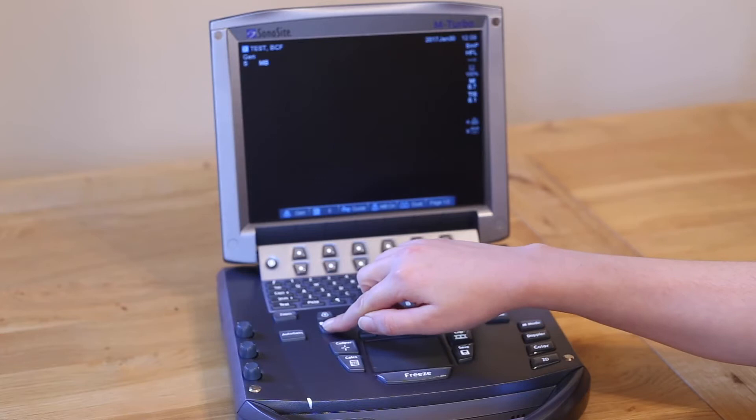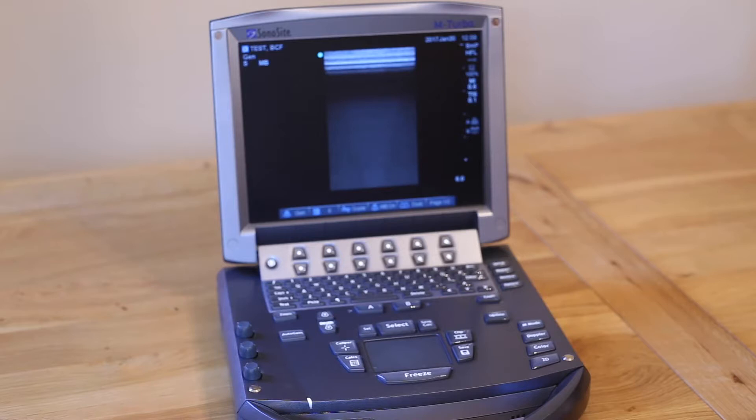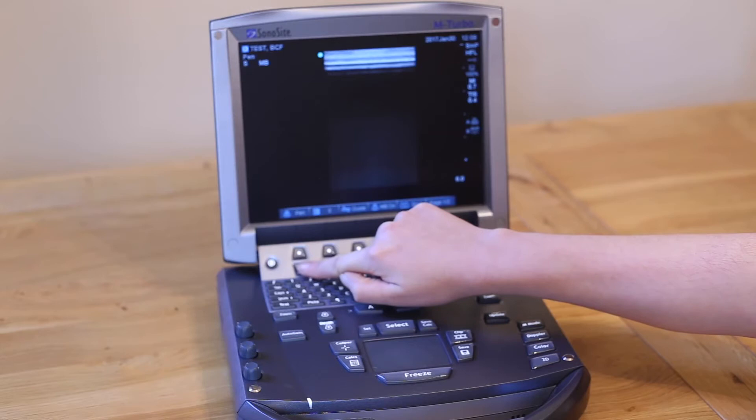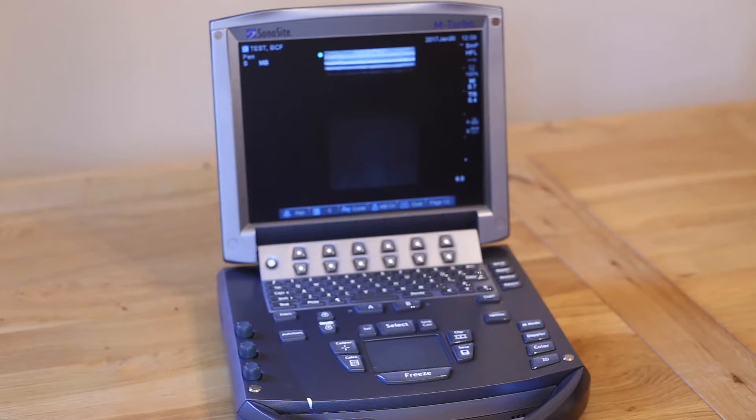Frequency. As you adjust your depth, remember to adjust your frequency at the same time to improve your image quality. Frequency is adjusted using the top left soft key. Notice on the screen that the options for frequency are res, gen and pen — short for resolution, general and penetration. High frequency waves give the best image resolution (res) and low frequency waves give the best penetration (pen) for deeper depth but resolution is compromised. General is in the middle.